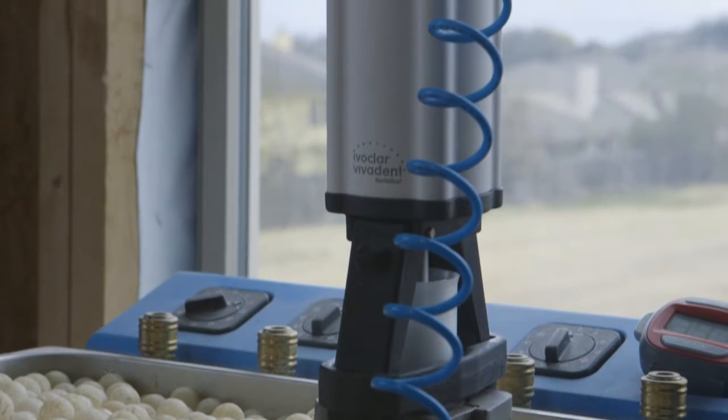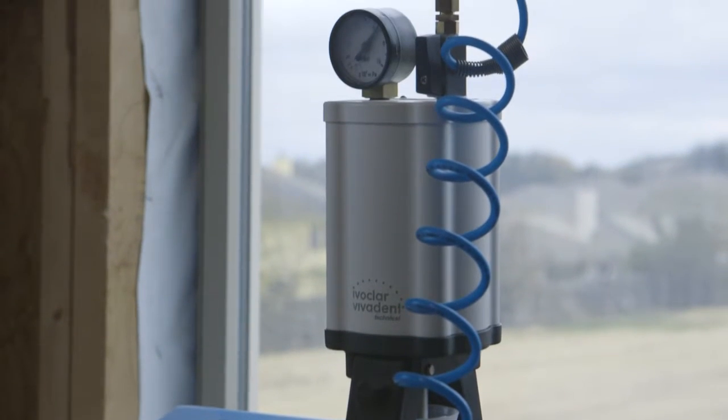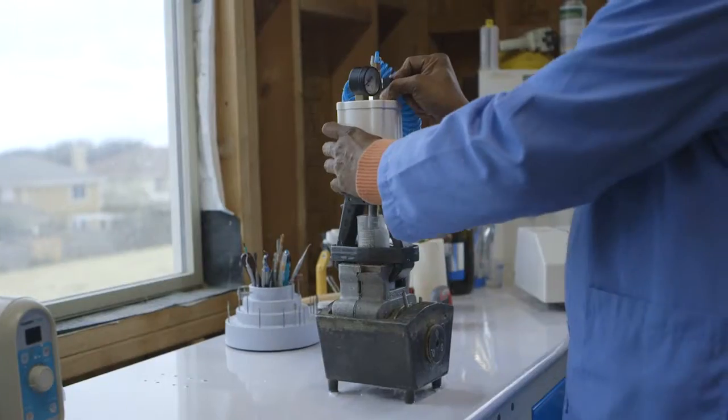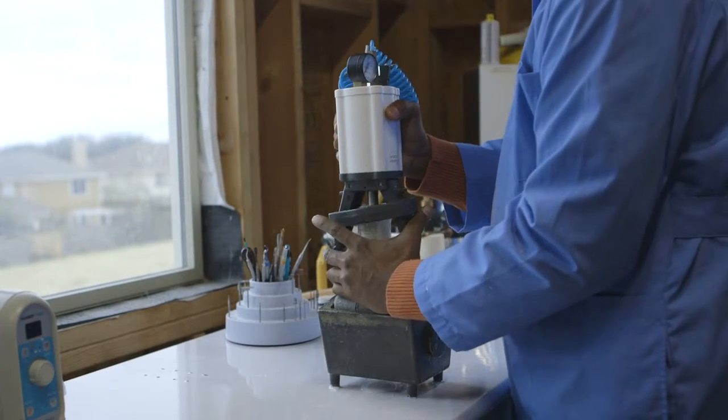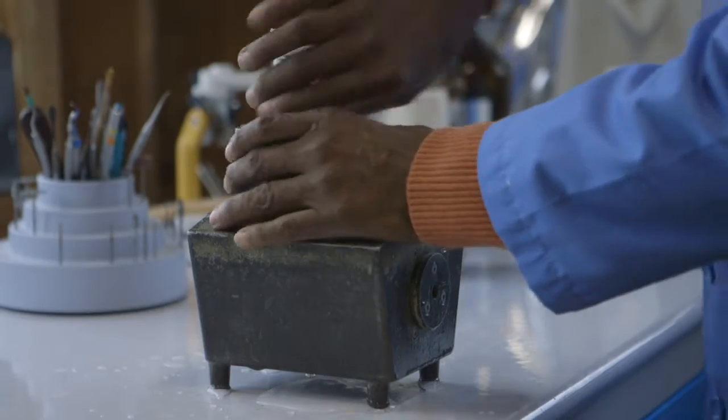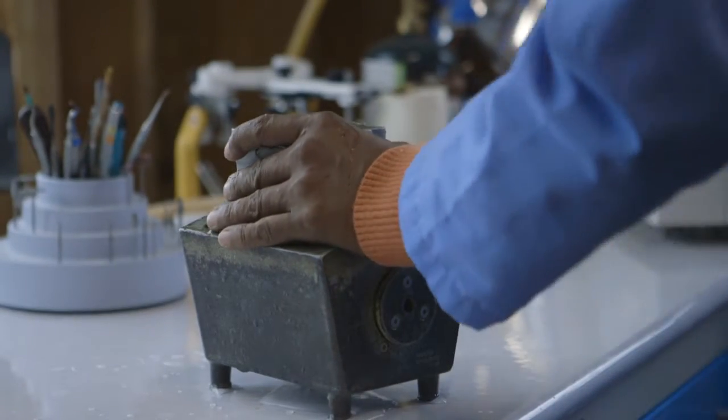The way that the denture is processed varies from laboratory to laboratory. We use some of the highest standards and highest quality techniques available. The dentures are first made into wax, and we use a beeswax that allows the patient to preview things, and we can move things in the wax. Once the patient likes the setup, we're able to process — I call it 'cook.'